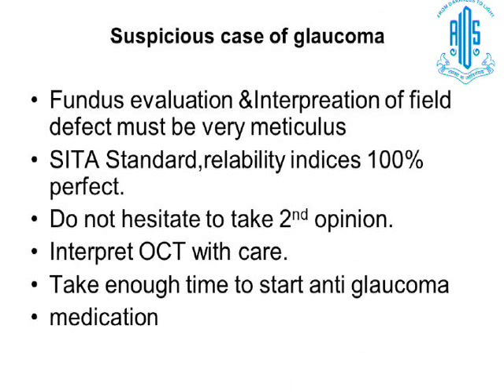So, when I see a suspicious case of glaucoma, fundus evaluation and interpretation of the field defect must be very meticulous. SITA Standard should be the strategy. Reliability indices should be 100% perfect. Don't hesitate to take a second opinion. Interpret OCT with care. Take enough time to start anti-glaucoma treatment.